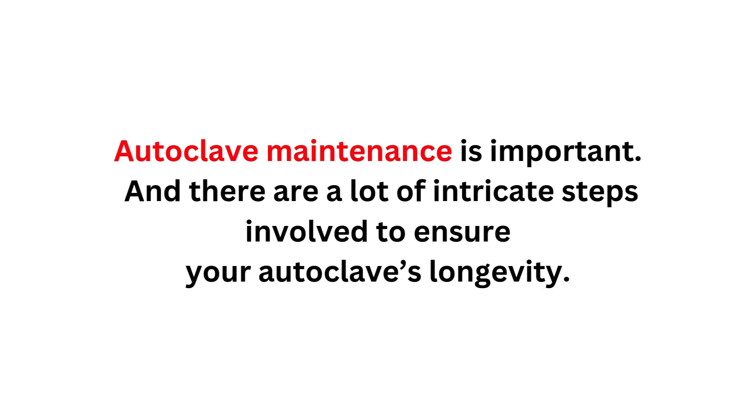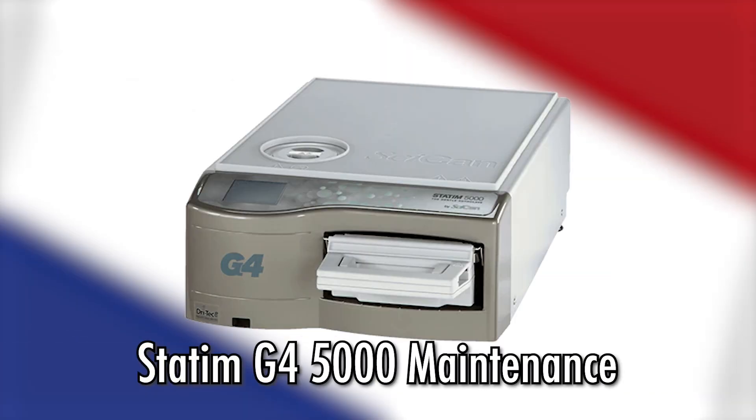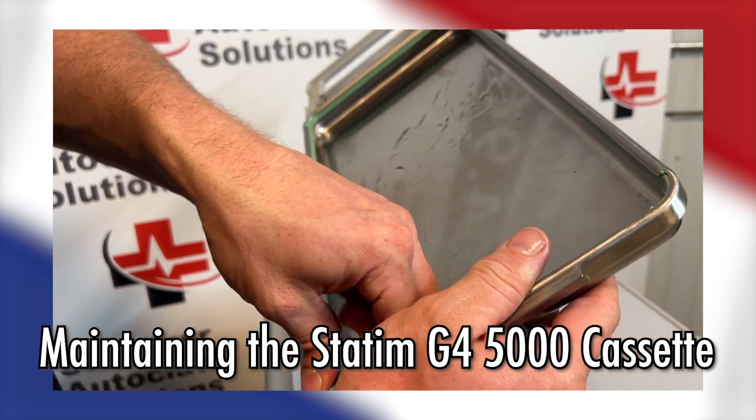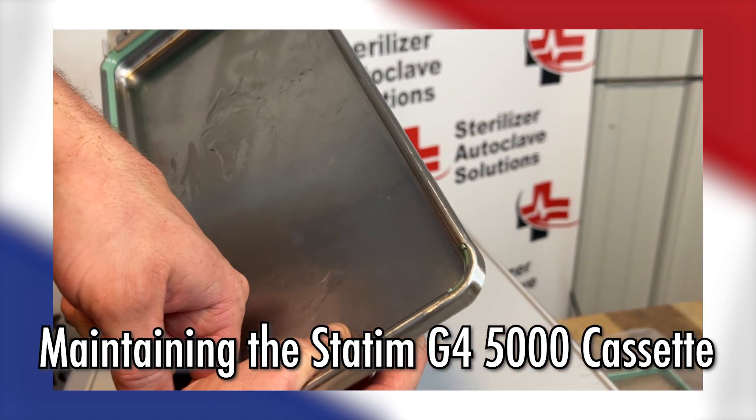Autoclave maintenance is important, and there are a lot of intricate steps involved to ensure your autoclave's longevity. Here at Sterilizer Autoclave Solutions, we understand that better than anyone. So we'll show you how we perform one of the maintenance steps for the Statim G4 5000 — specifically, how we maintain the Statim G4 5000 cassette. And we have Ian here to walk you through it.